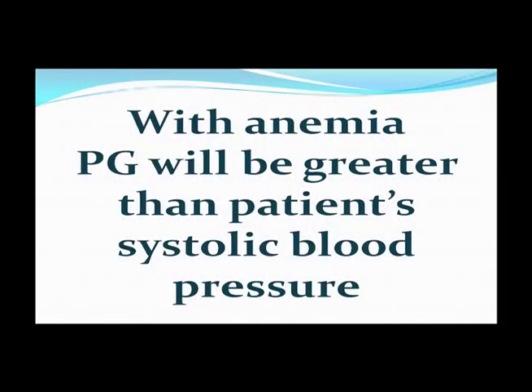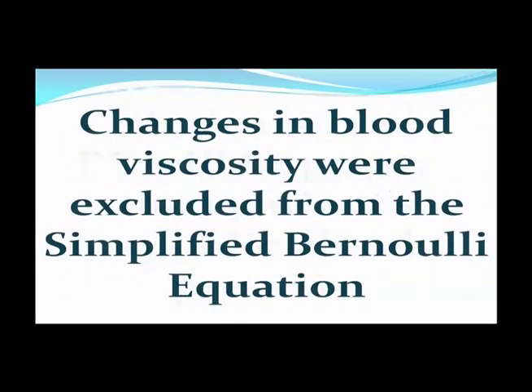Note that pressure gradients may also be overestimated in cases of anemia, where blood viscosity is decreased. The simplified Bernoulli equation does not account for changes in blood viscosity.